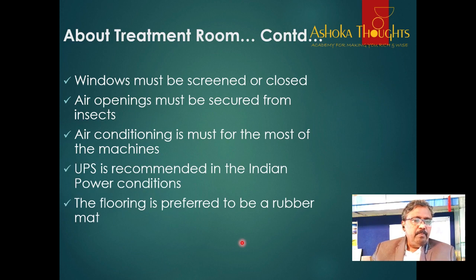The flooring is preferred to be a rubber mat. Why must the flooring be a rubber mat? Because there are tips of the IPL machine or tips of the Nd:YAG laser machine. If a tip falls on the floor, it may break. If the flooring is of rubber, then these filters or tips will not break. That's why it is preferable to have rubber flooring.